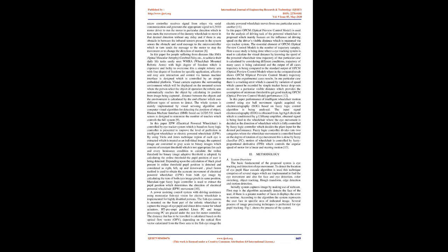The Tobii X120 is the eye tracker which is used to collect tracking data of the eye, where it uses a video camera and infrared light source which identifies the position of the eye pupil by corneal reflection data. It determines the 2-dimensional coordinates of the eye gazing point on the screen to identify pupil position, and signals are sent to the computer via network port which transforms eye tracking information into a wheelchair movement control signal.